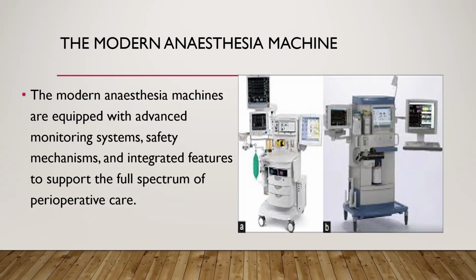But it's amazing to see the progress that has been made in the development of the anesthesia machine. Those days, we used to have multi-parameters separate. Now they are all incorporated into the anesthesia machine, like the ventilators I told you about. Those days, we used to have mechanical flow meters.